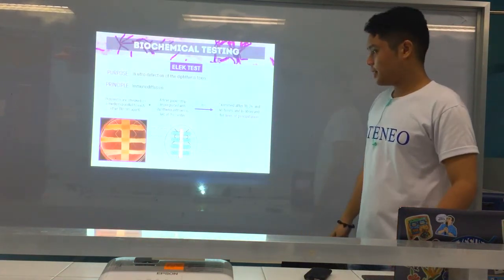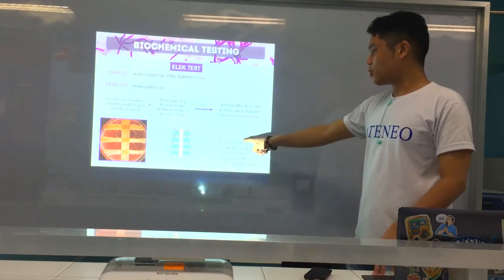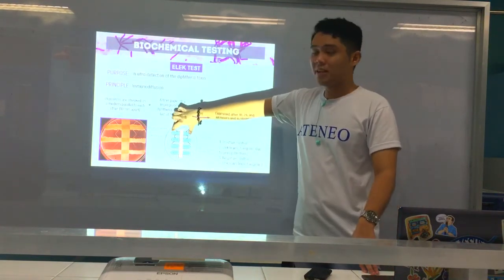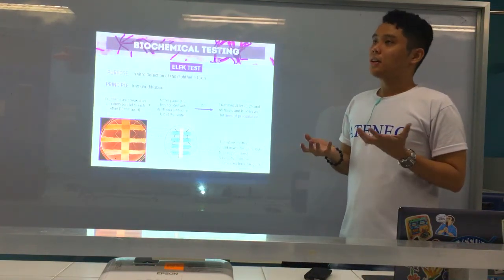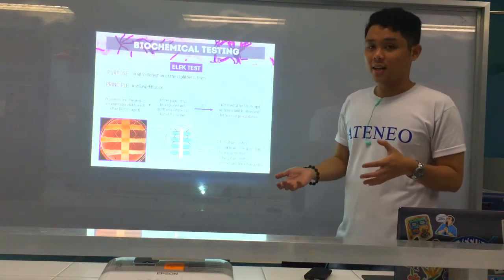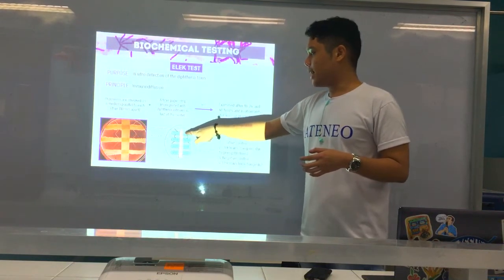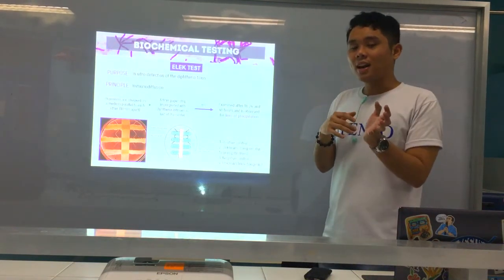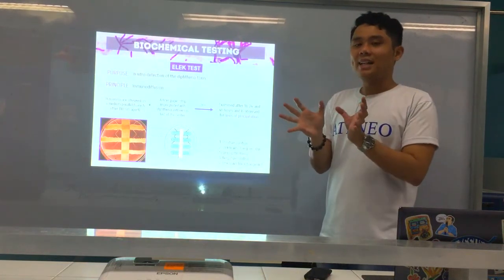So here as you can see, this is the control. Or in a lab setting yun. Meaning, ang control mismo, nag-release siya of toxin. Okay, control. Known organism siya to release toxin. So pag butang sa strip, of course, naay precipitin, meaning nag-react ang diphtheria toxin and the antitoxin found in the strip, kaya naay precipitin lines na na-create.